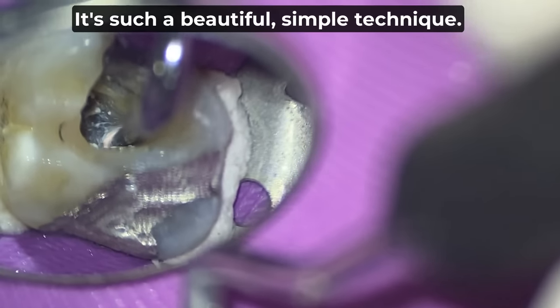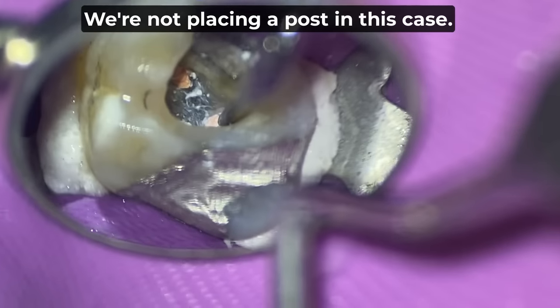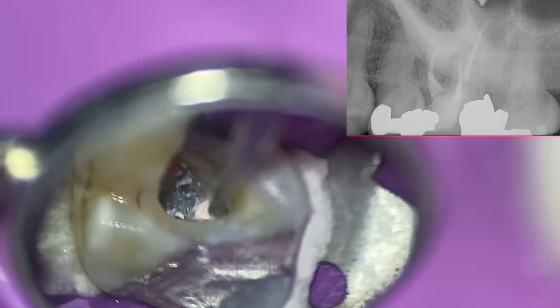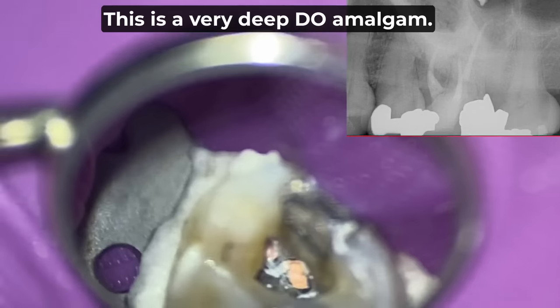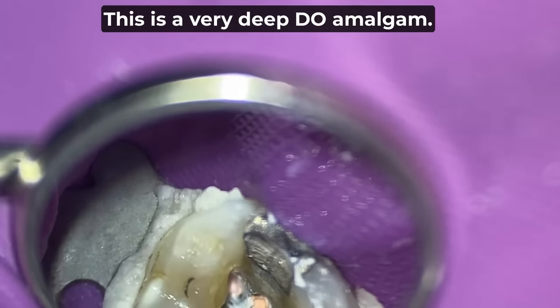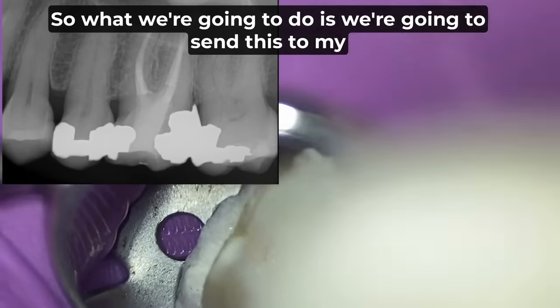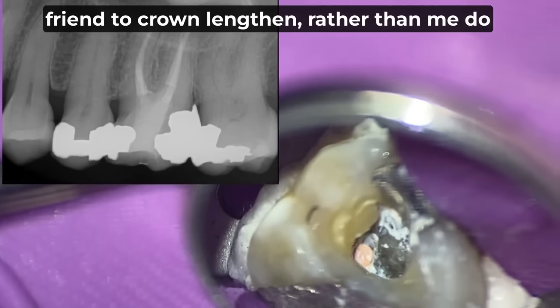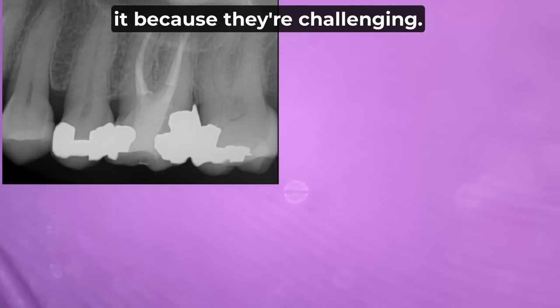It's such a beautiful, simple technique. We're not placing a post in this case. We're just placing a composite core. In these crown lengthening cases, I find this is a very deep MO, DO amalgam. There's a bit of an overhang, so we're going to send this to my friend for crown lengthening rather than me do it, because they're challenging and I'm good.